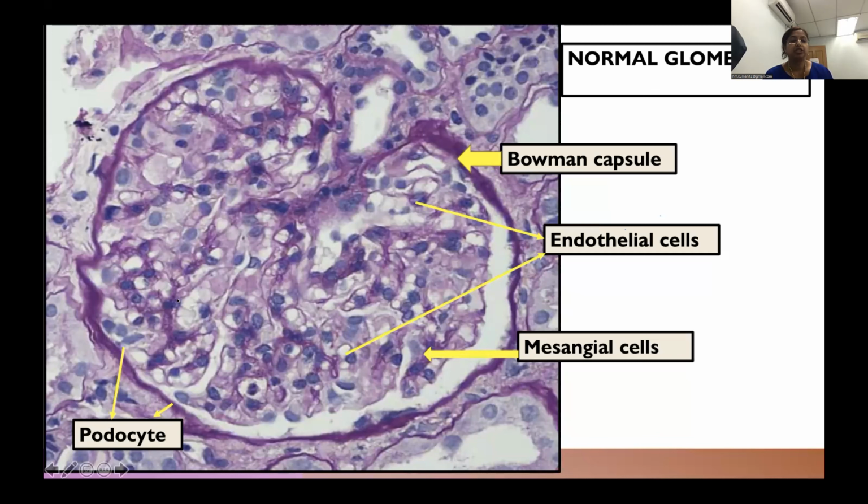And then whatever branches out like a tree over here, these are the mesangial component. A lot of people are still confusing mesangial hypercellularity versus endocapillary hypercellularity and still mixing up a lot of lesions. Okay, so this is the mesangial area with mesangial matrix and cells. Okay, endocapillary is over here. So these are your capillary loops. You have loads of capillary loops. They always form like flowers, like petals. So in these capillary loops, the inner cells over here are the endothelial cells of the capillary loop. So whatever occludes here will be endocapillary. I'll show you some images.